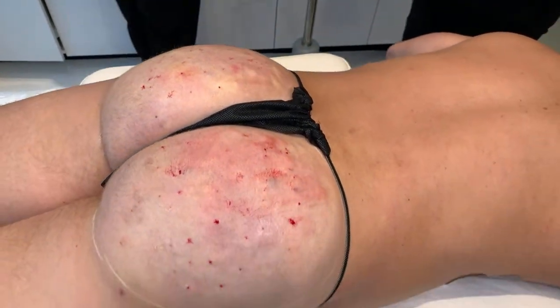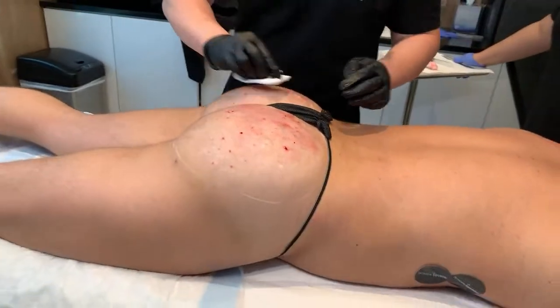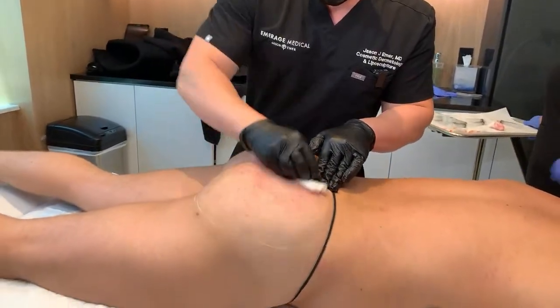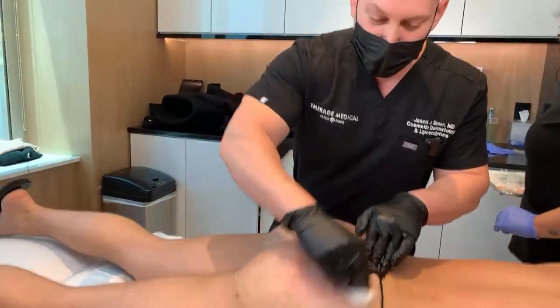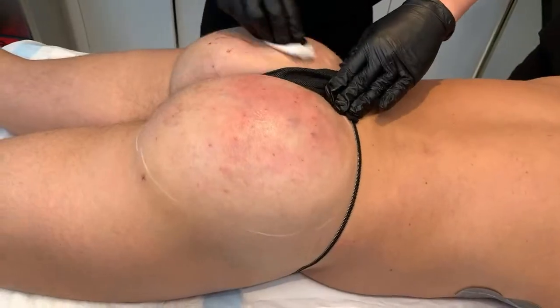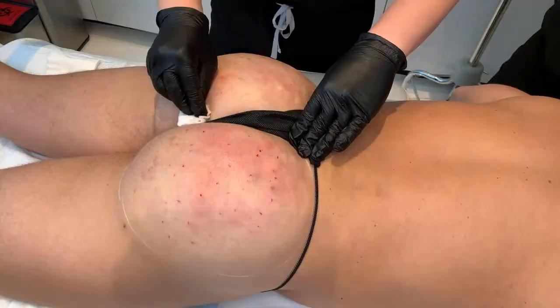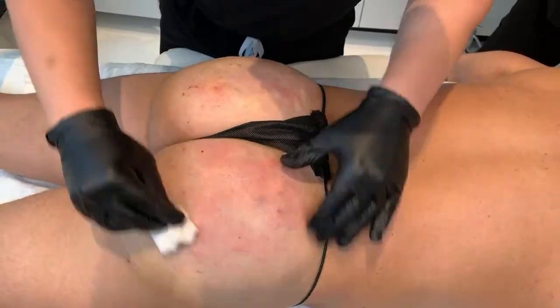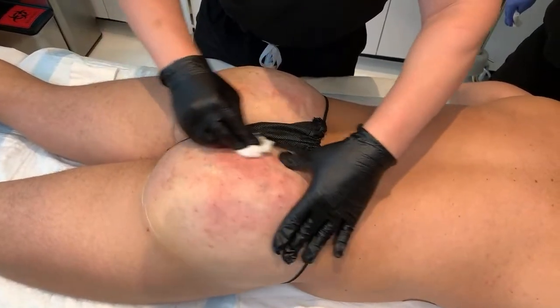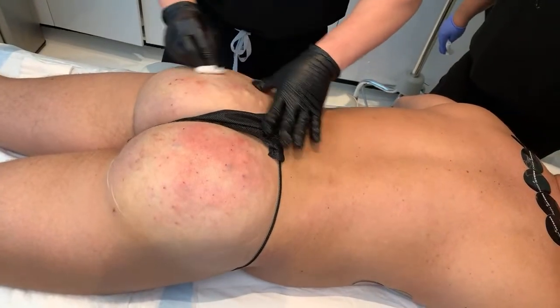Now we're gonna clean. And then really what I do, the best part right now, is we have our medical assistant do massage. And then you get a little butt massage. That's the best part. And then I always require whoever's taking care of the client to do a butt massage later tonight. But that's it. And then you guys could see the whitening effect there, where all the particles are going in. That's numbing medicine that's inside, and we just lightly massage it in, and it seeds the area, and we're gonna see it grow and build as he works out.